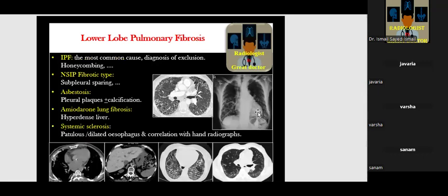In case of fibrotic changes present predominantly in the lower lung bases, with a shaggy outline of the heart border and loss of definition of the diaphragm with reduced volume of lower lung fibrosis, think of IPF if no visible cause. If there is pleural calcification, think of asbestosis.